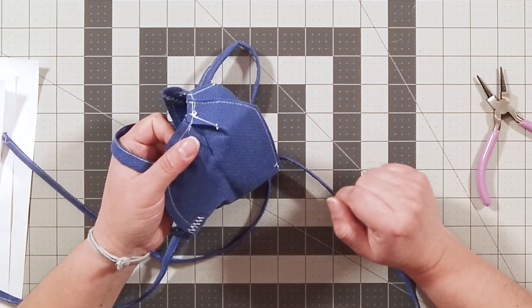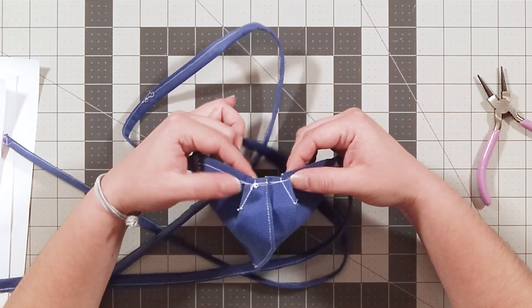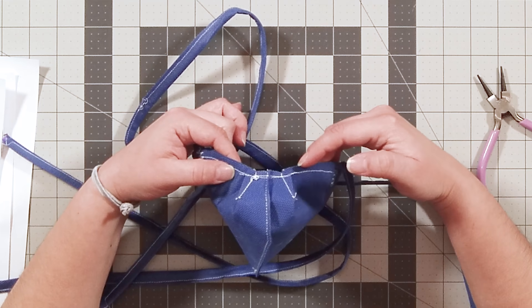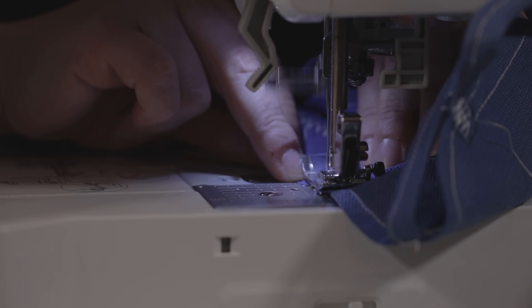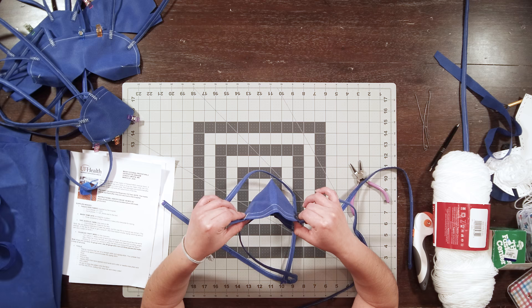Trim off a little excess. The final step is to reinforce your bottom seam — just stitch across all the darting to reinforce that area. And that's it — you've completed your mask.